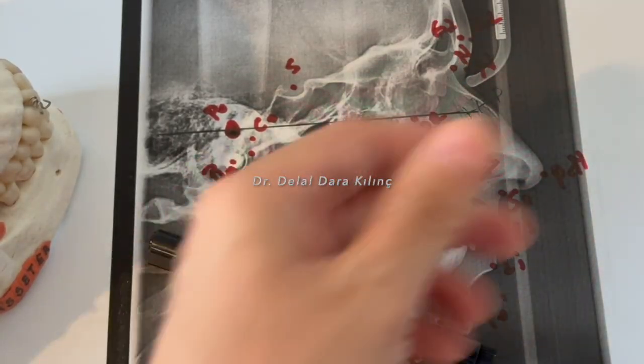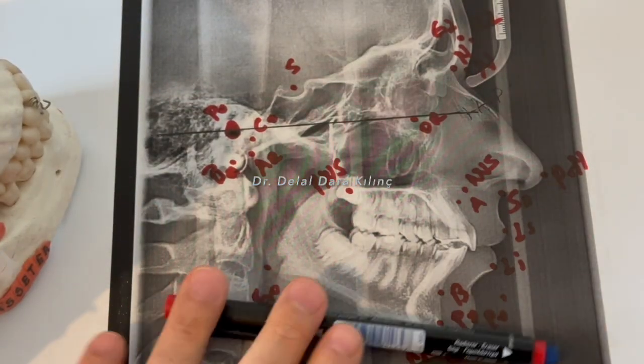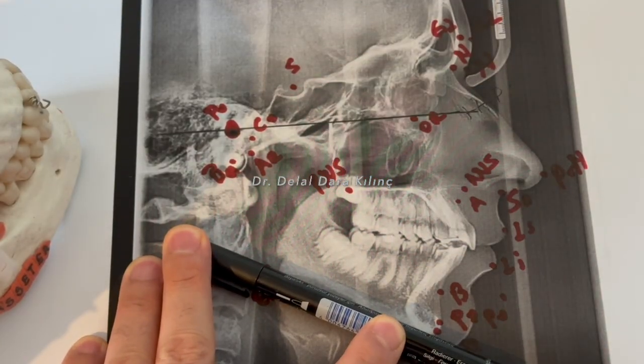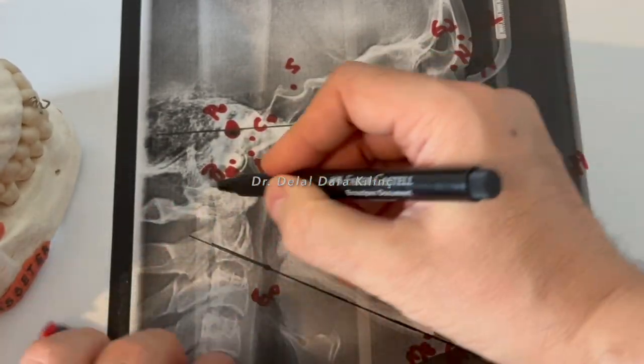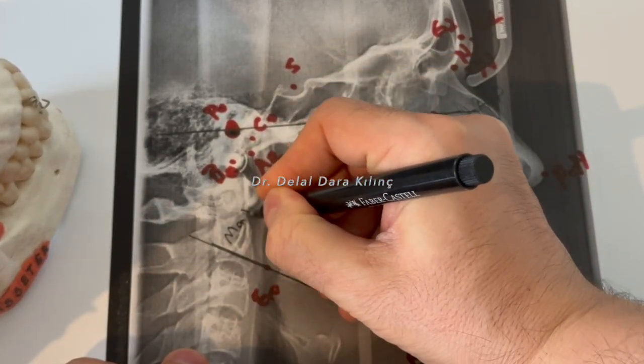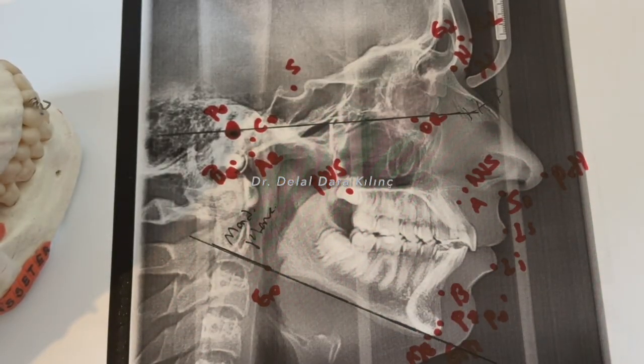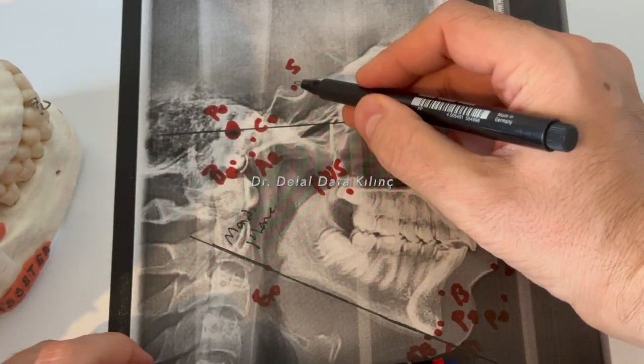As mandibular plane, I'm going to draw it with black. Yes, here, Gonion-Menton, it's the mandibular plane. This is the mandibular plane, here you see it. And let's draw the Sella-Nasion line, it's passing from the point Sella.